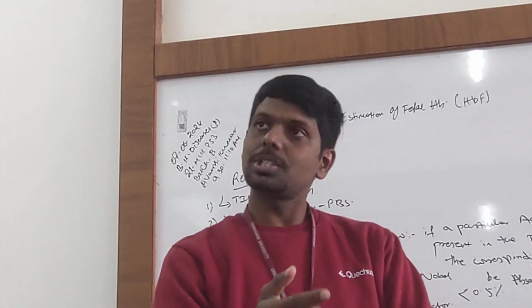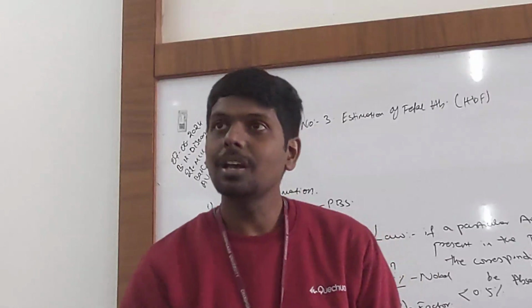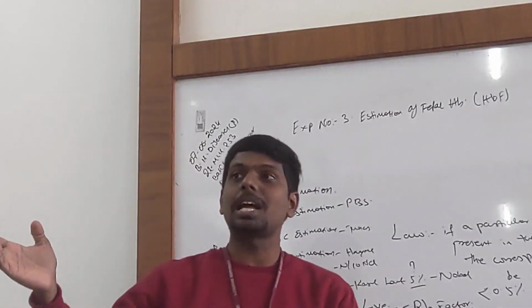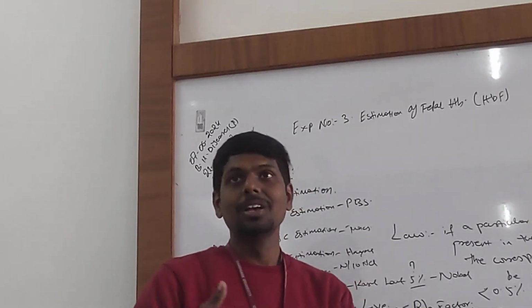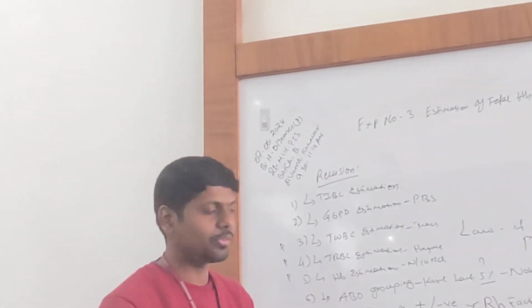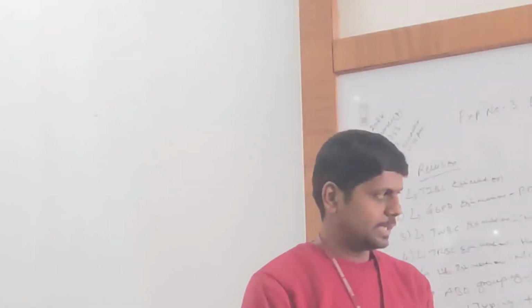That's why I need to check the mother's antibodies, or any patient's. No patient will say whether they have a previous history of transfusions, or whether they unknowingly got a positive group despite being negative, no one will say. So we must do cross matching. We need to cross verify. That's it. Then part 2 of today's lecture.